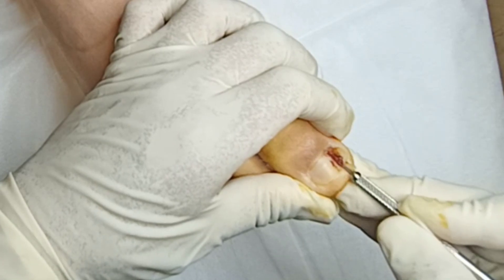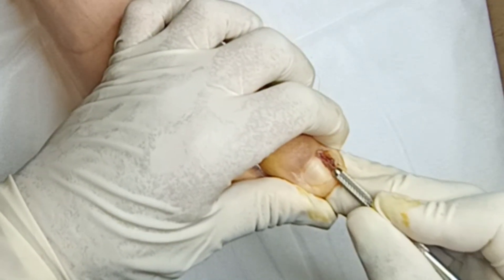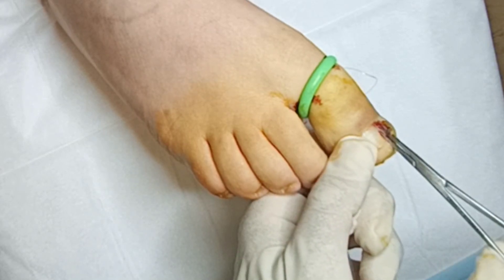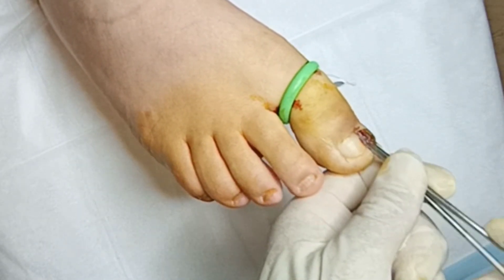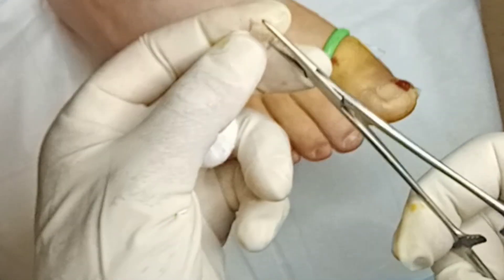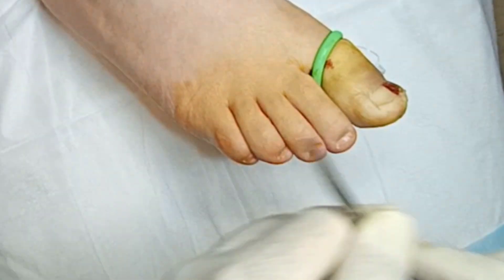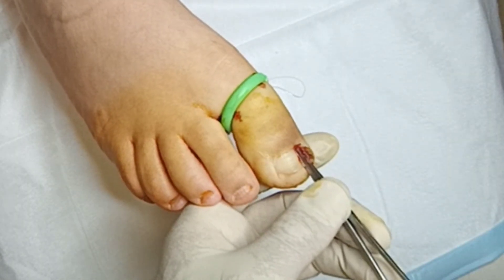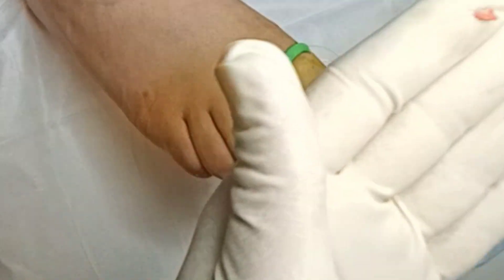Don't do two cuts — try to do it in one consistent cut. You get a little bit of resistance but just keep going until you either feel bone or feel that it's freed up. Then we get our forceps, clip the nail we want to remove, and rotate to the medial side of the toe. A lot of times when you're doing the medial side, it comes out in two sections — and we'll see that here. So that's one nail out — the distal part. However, you can't see the end of the matrix, meaning there is more nail in there. So we go back in, grab the other portion, rotate medially, and take out that section too. You should be able to look in and see a nice clear channel to where the matrix was.